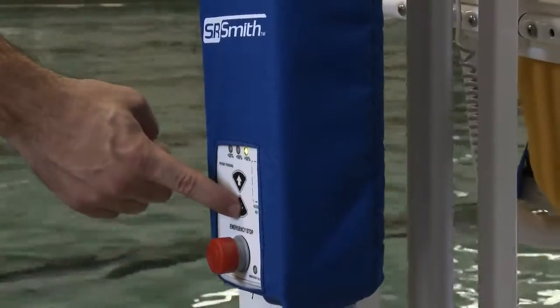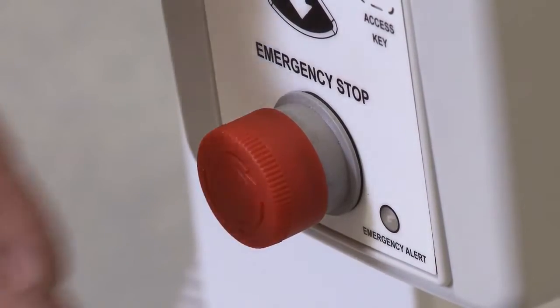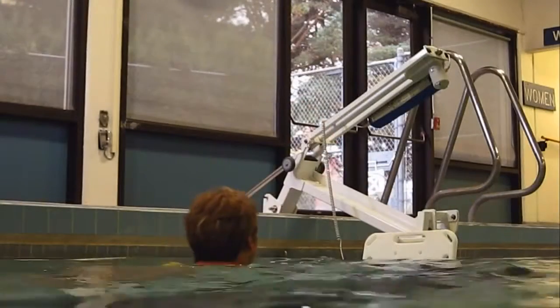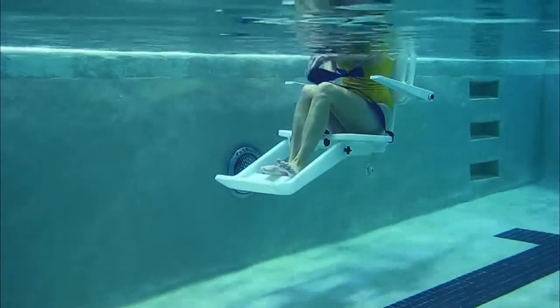The touch pad on the lift operator can also control the lift. When the emergency stop switch is activated, the lift immediately stops moving and emits an audible alarm. When the user has completed their activity, they easily and safely exit the pool using the multi-lift.